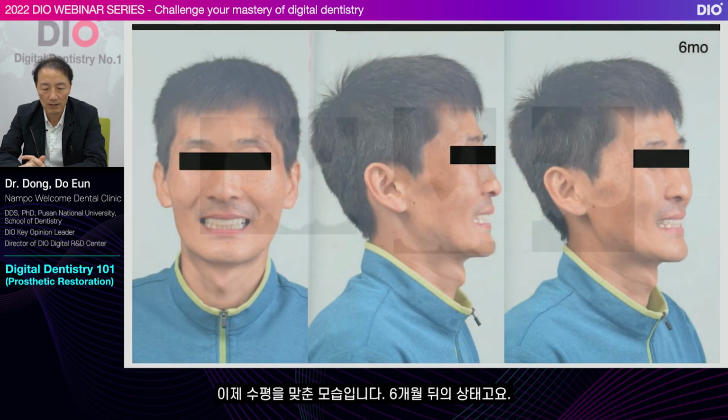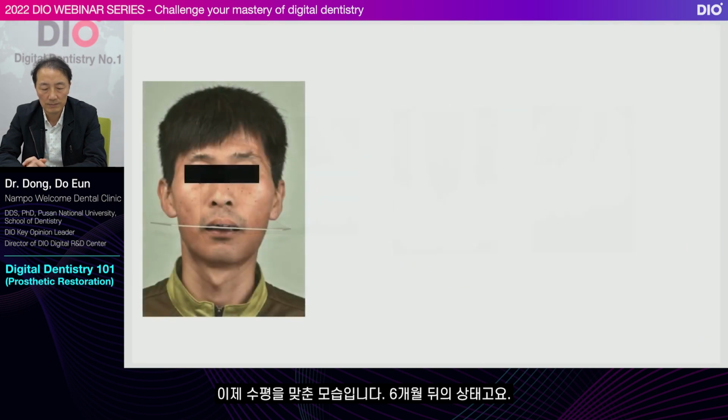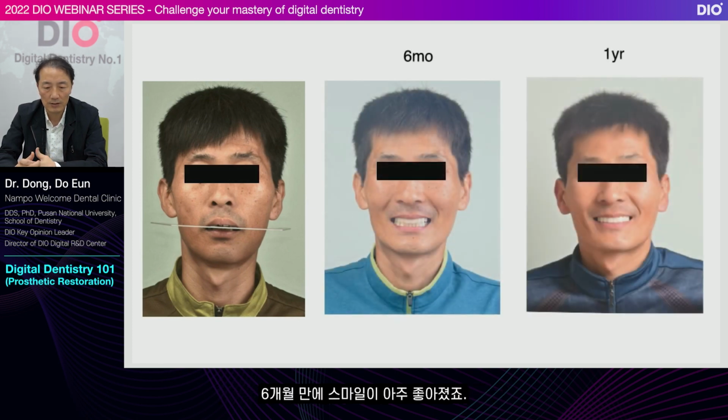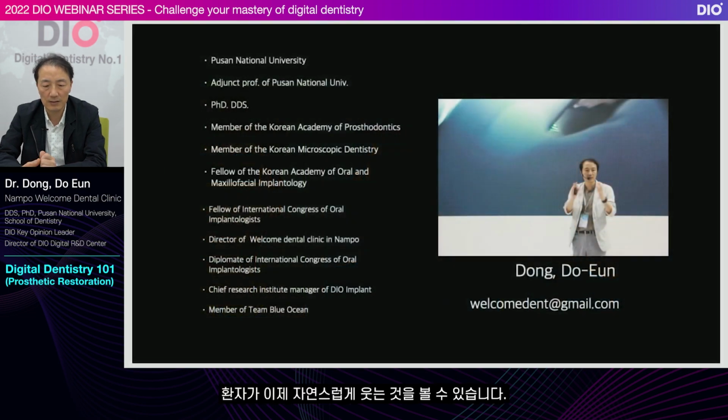This is 6 months later. The smile improved remarkably in just 6 months. This is 1 year later. Now the patient has a beautiful natural smile.